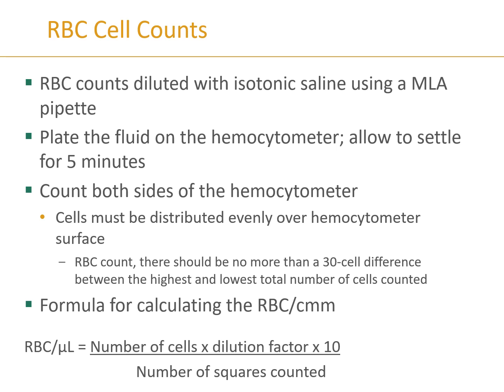And of course, once you plate those cells, you do need to let them settle to be able to settle out all on one plane. And then you would do your counts and get those averages based on a number of cells that you count per side. And again, you could do them individually, side A, side B, and do that comparison to make sure you get within 10%. And then also you could do the total number as far as for your reporting.